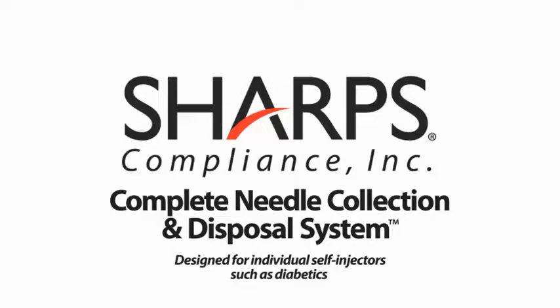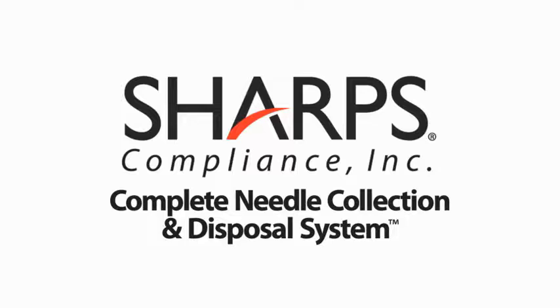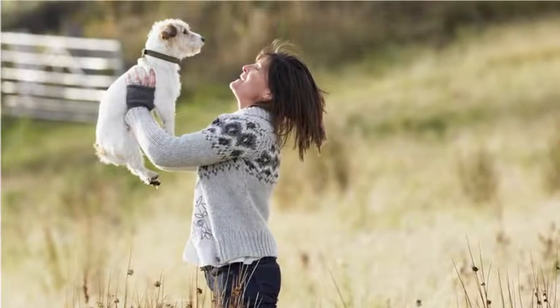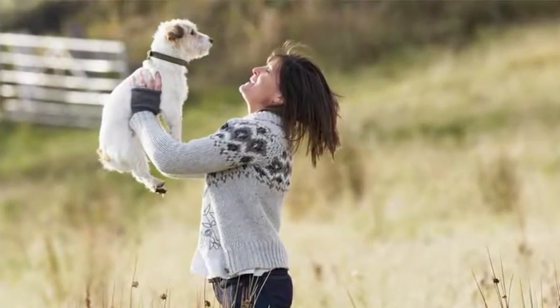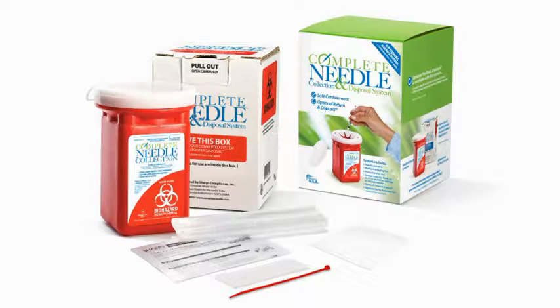By using the system, you will comply with many state laws and guidelines and make sure that your sharps don't end up in the trash where they could injure someone. You can feel proud that you are doing the right thing to protect people, pets, and the environment. We have prepared this video to show you how easy it is to use and dispose of your Complete Needle System.